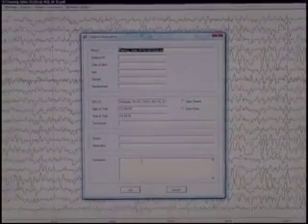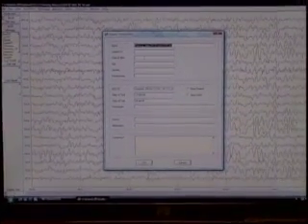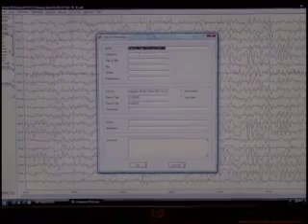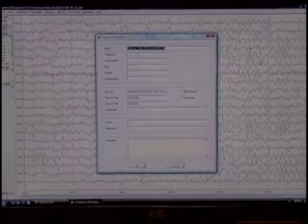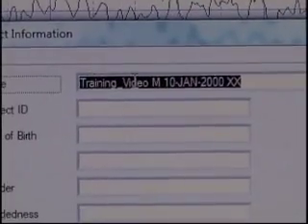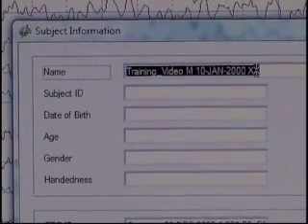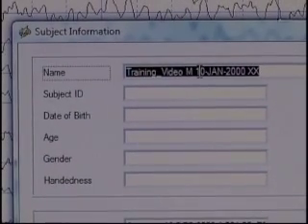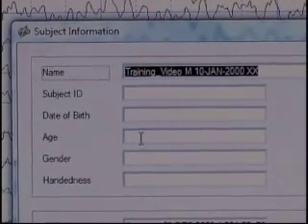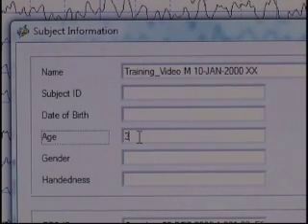Now the EEG has been read in. You can see the EEG behind us, but we have to finish up some subject information here. It did load in the name, Training Video, and put in the birth date that I had typed in, which we'll leave. Here's an area for age — I'm going to type in a number there.